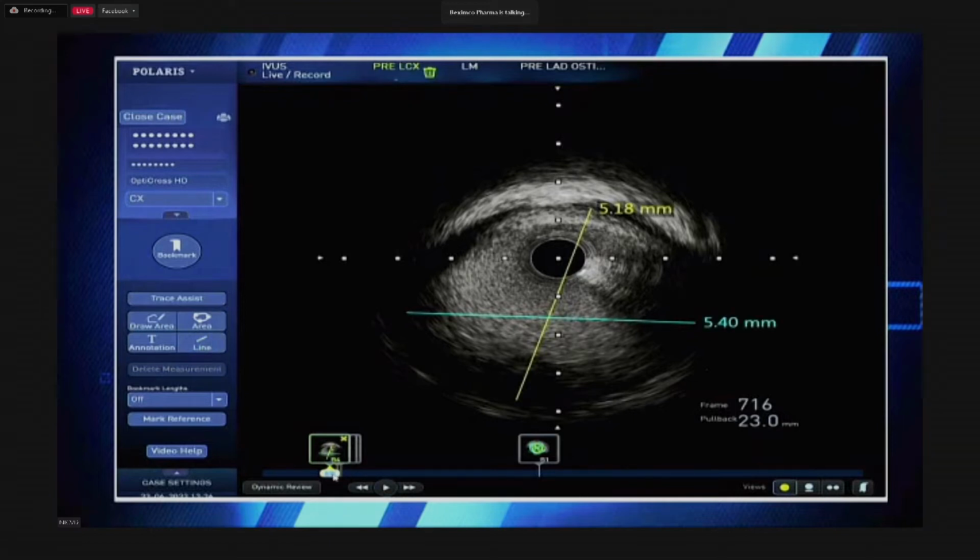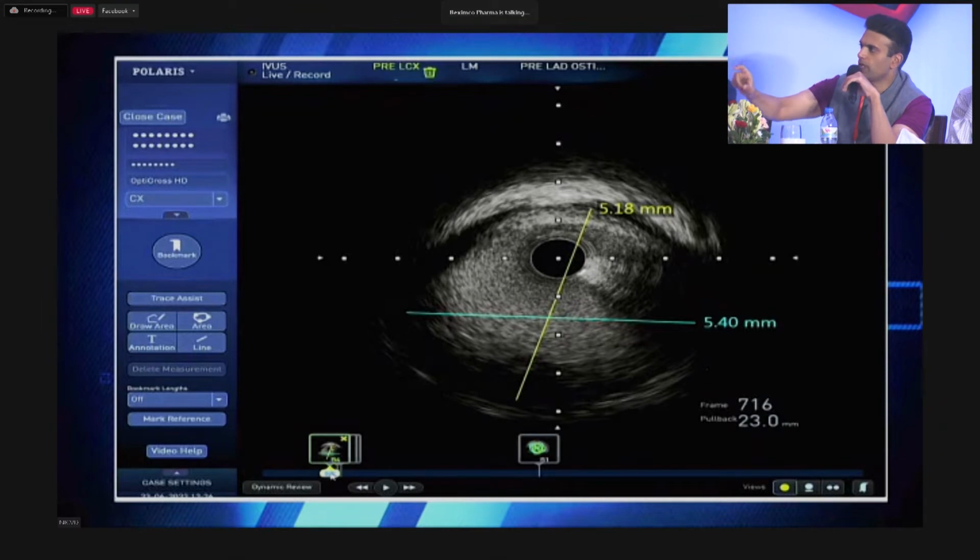So in this case, your left main, even the sizing measurement there towards the bottom part of the left main is getting into plaque. It's a reasonable approximation. It's a big left main. We can accept that. But one has to be careful if you've got a ton of plaque within the media, because you can oversize your vessel size estimation, right? That's why we try to stent normal to normal, and with IVUS-based stenting, you tend to put in 1 millimeter bigger but longer stents, because you're trying to stent normal to normal and actually get a uniform result.